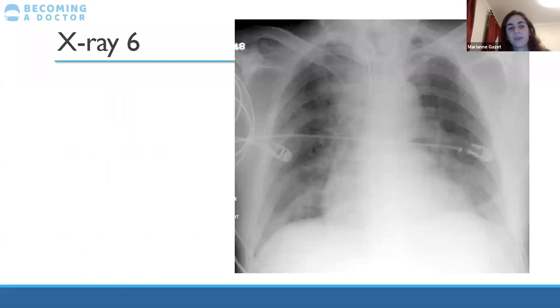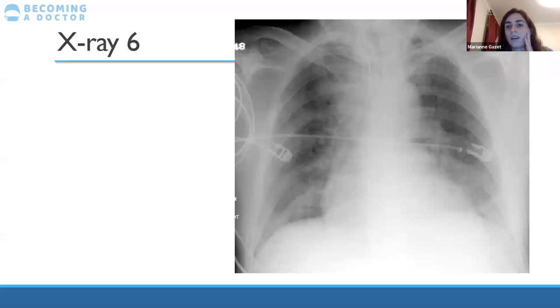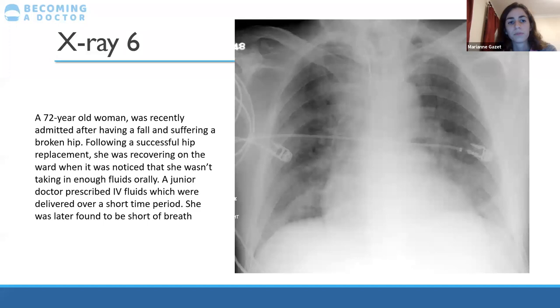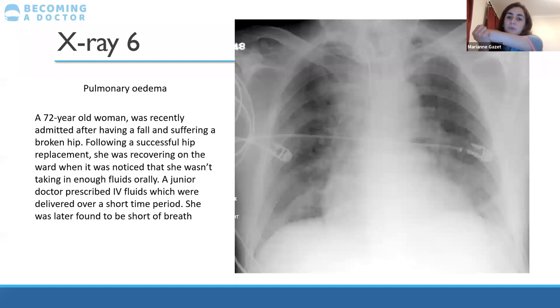X-ray six appears very white and overexposed — we can't see much, it's not very good quality. But this is the pulmonary oedema we were talking about: you can see how all the lungs look white and very fuzzy, as if there's a veil of whiteness across them. That's the characteristic appearance of pulmonary oedema — fluid in the tiny blood vessels of the lung causing diffuse bilateral whiteness.